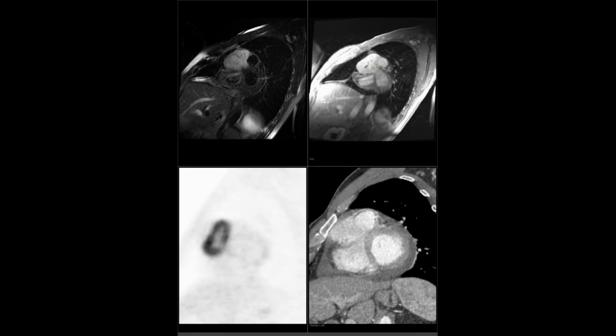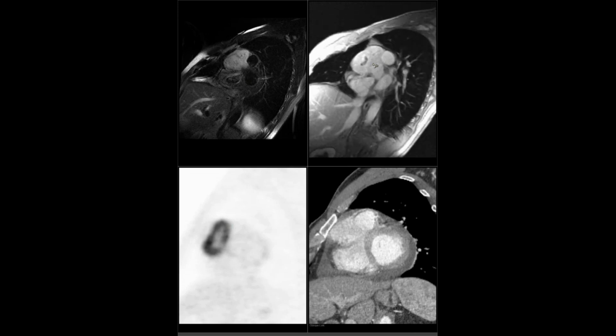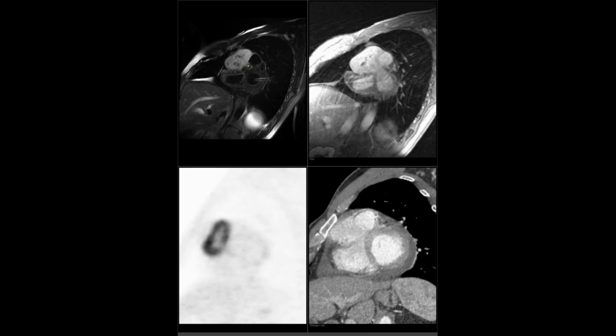Also had an MR. Unfortunately, the patient couldn't tolerate the MR and left before we could get the delayed post-gads. You can see here in the early post-gads, very bright. Here's the T2 fat sat, fairly bright with some areas of low intensity. Based on this, it's a follow-up from last week, and we said it could be hemangioma given the degree of enhancement. I think the degree of FDG uptake makes that pretty unlikely. So I favor this to be either an angiosarcoma or a dedifferentiated paraganglioma.